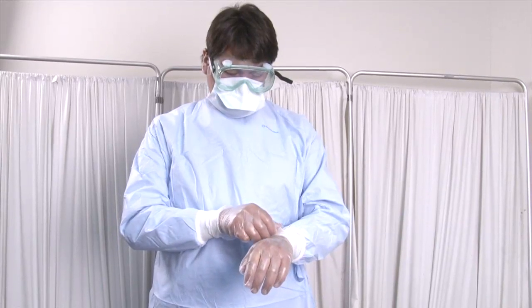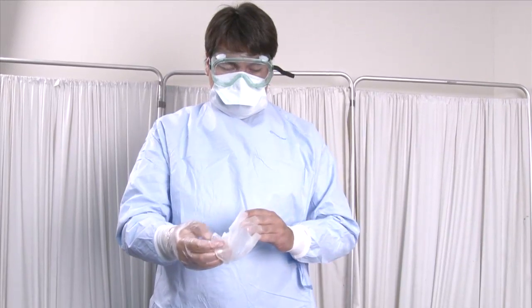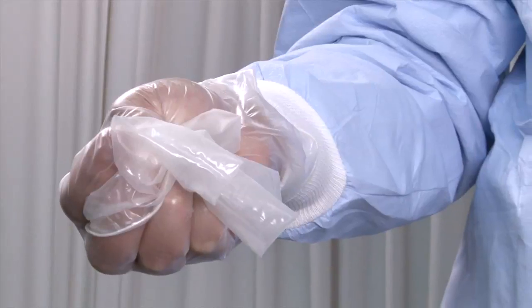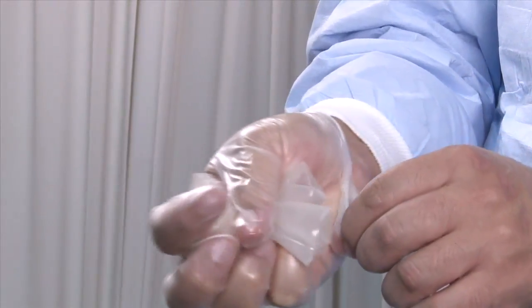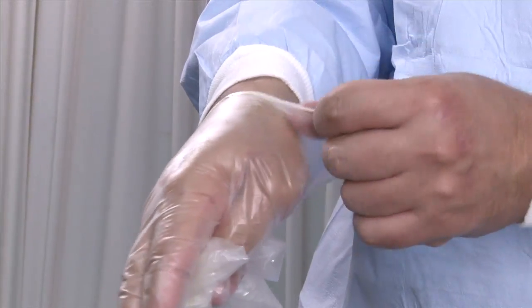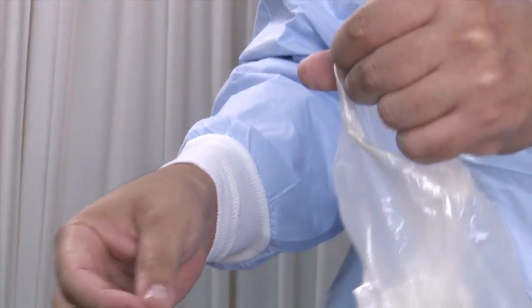Step 6 — Removing gloves: Remove your gloves by grasping the outside edge near the wrist and peeling away from the hand, turning the glove inside out. Hold the glove in the opposite gloved hand. Slide the ungloved finger under the wrist of the remaining glove and peel off from the inside, creating a bag for both gloves. Hold the gloves in the biosafety bag.